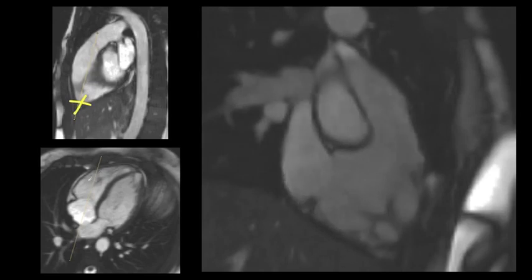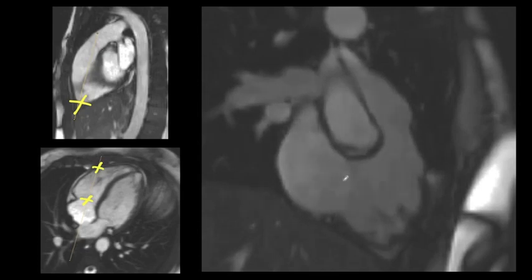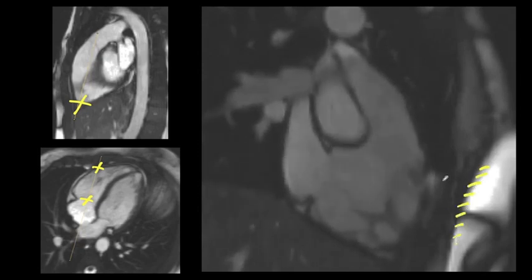You use your RVOT. This time you cross-cut going through the apex, and you use your anatomical four chamber and you cross-cut through the tricuspid valve going to the RV free wall. This gives you your RV in and out view. In this particular image, you can see some wrapping artifact here, but it is not affecting your cardiac structure. It's not affecting the RV, so you can still use this image.